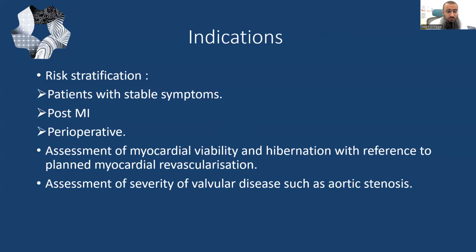Usually the indication is a patient with stable symptoms, or a patient post-myocardial infarction to assess viability, or preoperative assessment in patients with elevated risk. Also the assessment of myocardial viability and hibernation with reference to planned myocardial revascularization, and the assessment of severity of structural heart disease like HOCM or aortic stenosis.